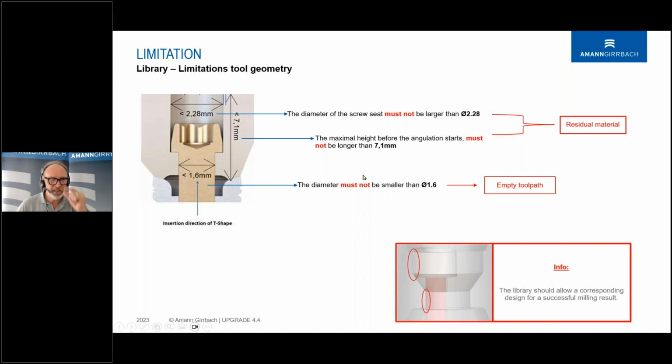And then you can easily use the T-shape burr for angulated screw channels in these kind of titanium bars. And by the way, titanium is easy to mill in our Matic. I tested it for a long time. It's easier to mill than cobalt chrome.